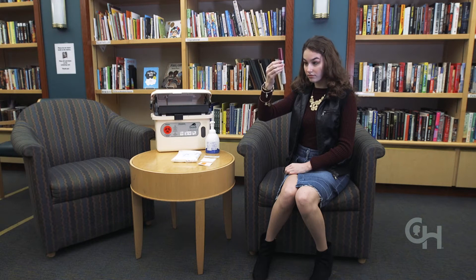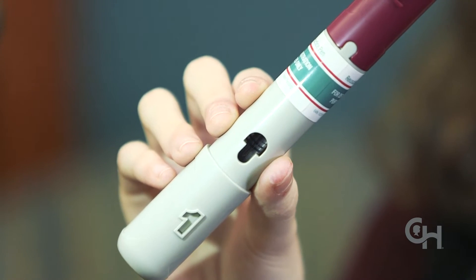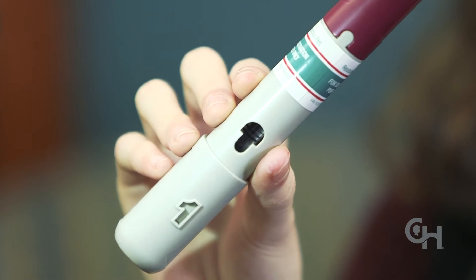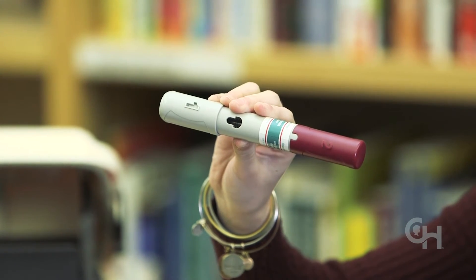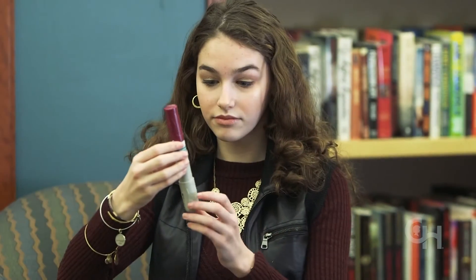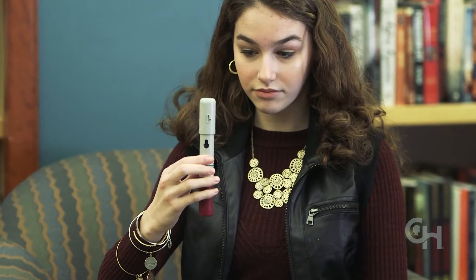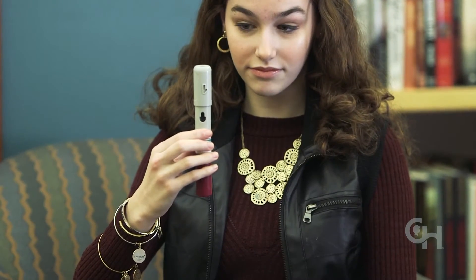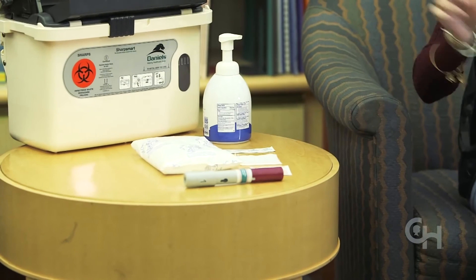Hold the pen with the gray cap pointed down. Make sure the amount of liquid in the pen is at the fill line by looking through the window — this is the full dose of medicine you will give. If the pen does not have the full amount of liquid, do not use it and ask an adult to call your pharmacy. Turn the pen over with the gray cap now pointed up and make sure the liquid is clear and colorless. Do not use your pen if the liquid is cloudy, discolored, or if it has particles floating in it. Ask an adult to call your pharmacy.